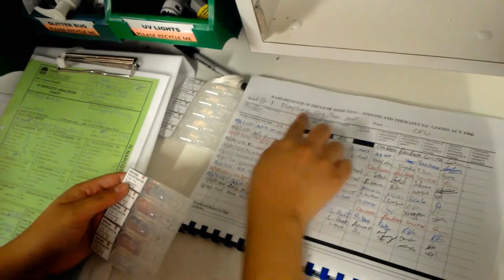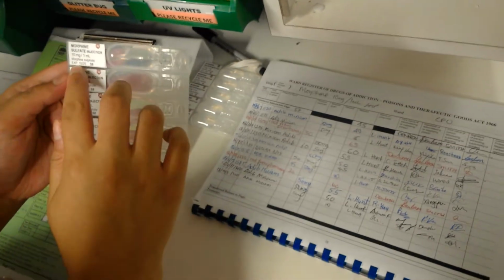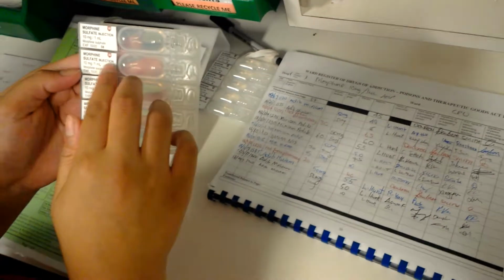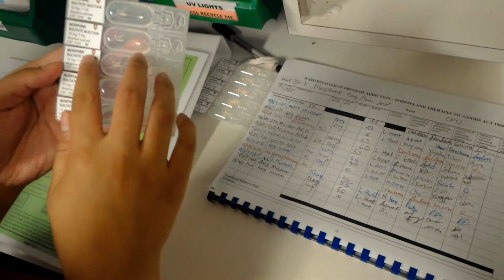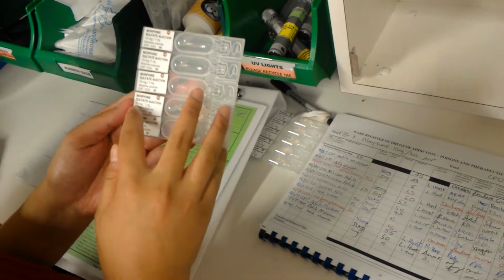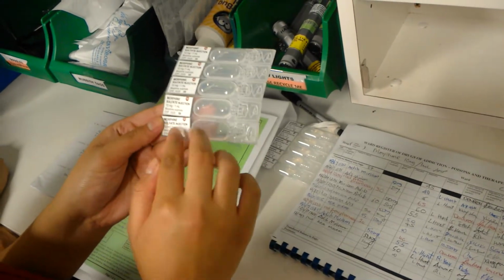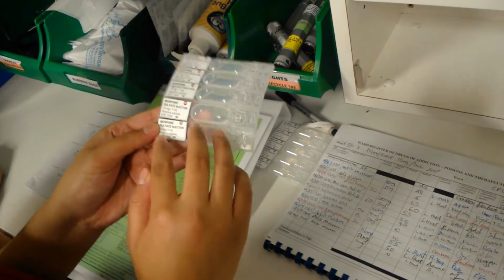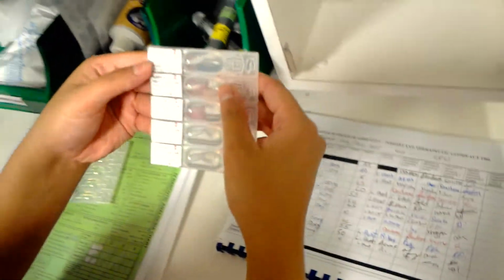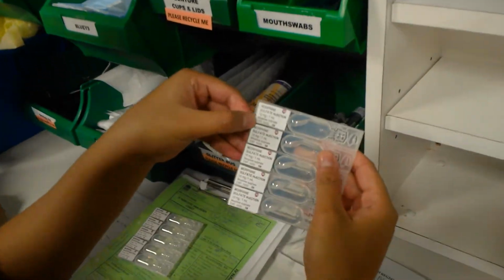So I've got morphine 10 milligrams in 1 ml. Expiration date is 10/20/20. Morphine sulfate injection 10 milligrams in 1 ml, expiration 10/20/20. Morphine 10 milligrams in 1 ml, expiration October 2020. The last vial, morphine 10 milligrams in 1 ml, expiration is 10/20/20. And this is what I'm taking, and this is what I have left, all with the same expiration date.